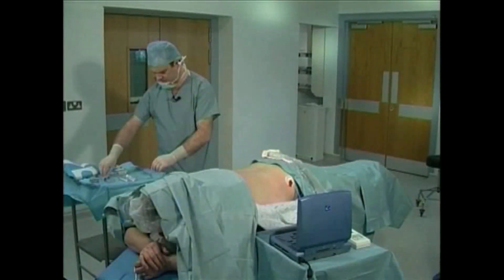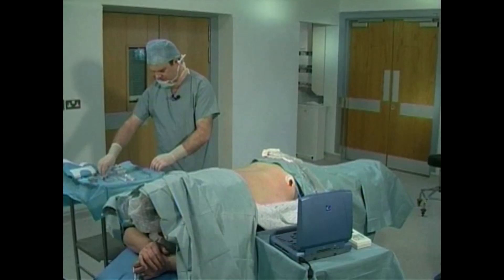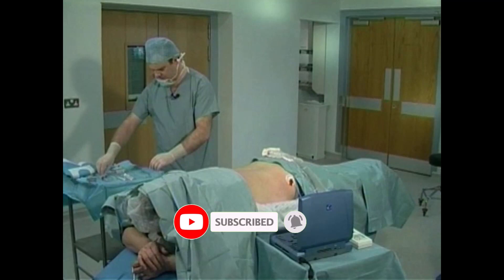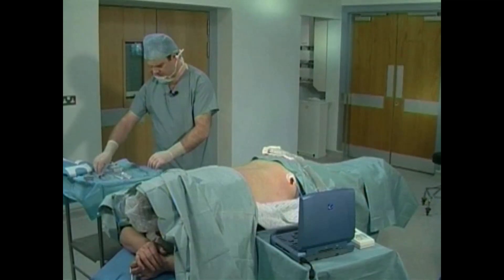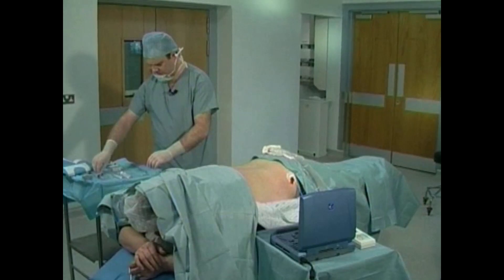The psoas compartment block is designed to anesthetize the femoral, lateral femoral cutaneous, and obturator nerves. By doing so, this block provides post-operative analgesia for hip and knee surgery. When combined with a sacral plexus block, it may be used to provide anesthesia for lower leg surgery.